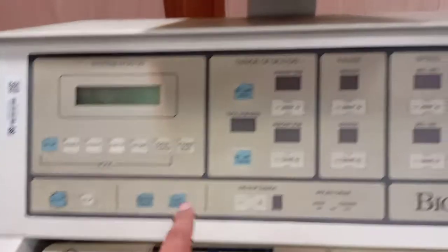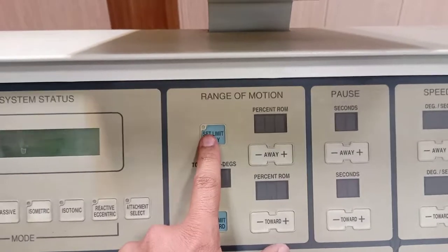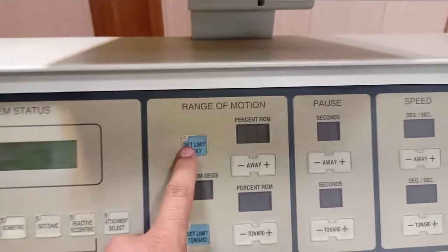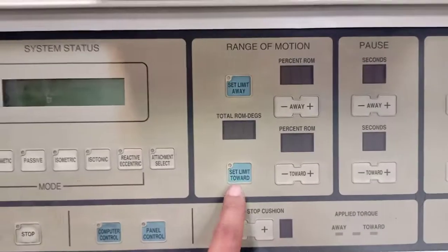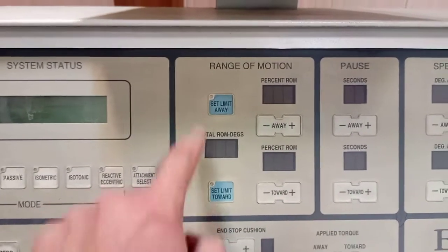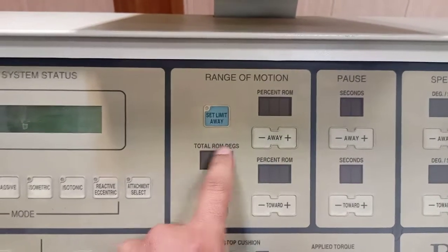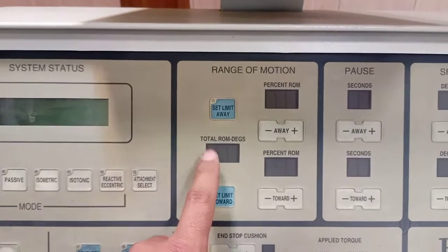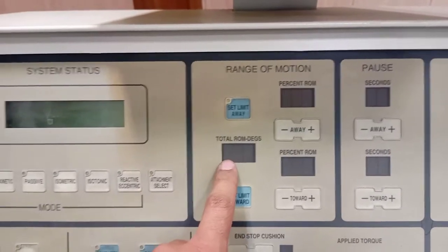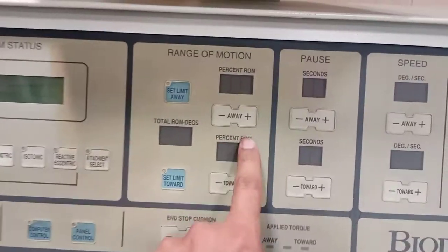You can also set the limit away. These are the range of motion parameters that you can use. For example, if you want to limit the knee extension, you can set the limits. So this is towards limit — that will be flexion — and this will be extension, in the example of knee extension. Total range of motion degrees are displayed here. If you want to measure, say, 100 degrees of flexion or extension, you can set this and choose the percentage of ROM as well.